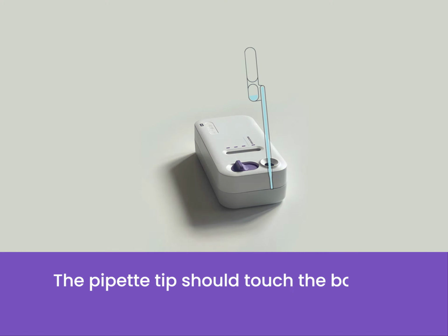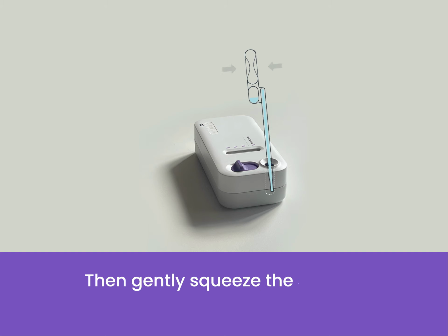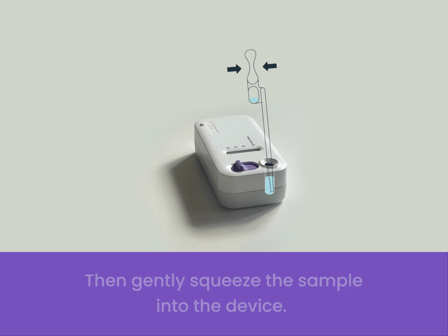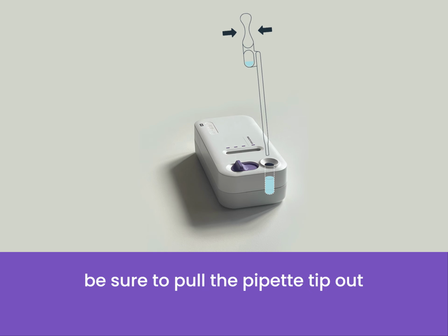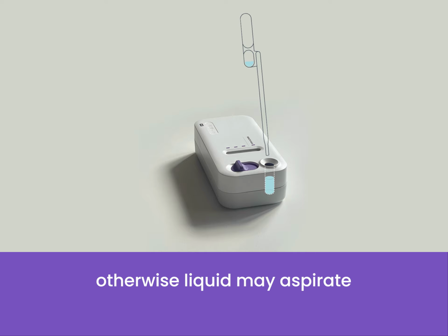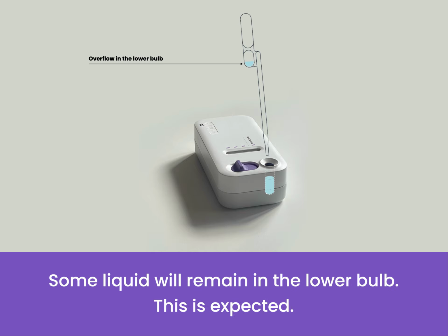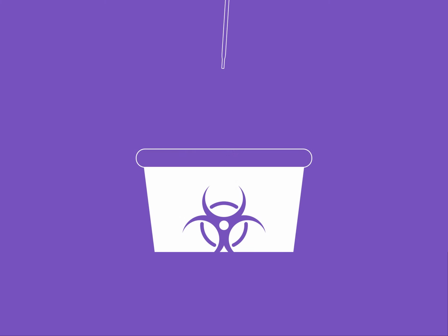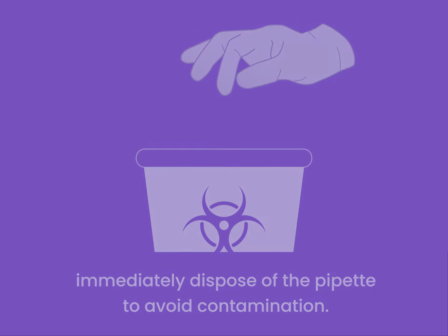The pipette tip should touch the bottom corner of the well when inserted into the port. Then, gently squeeze the sample into the device. Once the sample is added, be sure to pull the pipette tip out of the liquid line, otherwise liquid may aspirate back into the pipette. Some liquid will remain in the lower bulb. This is expected. After the sample is loaded into the device, immediately dispose of the pipette to avoid contamination.